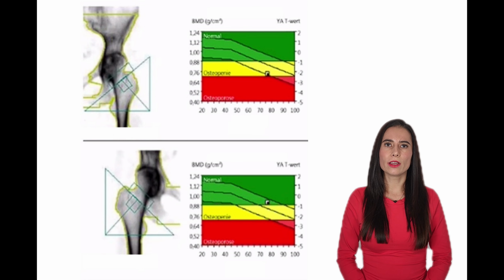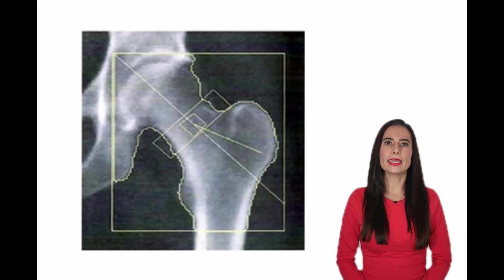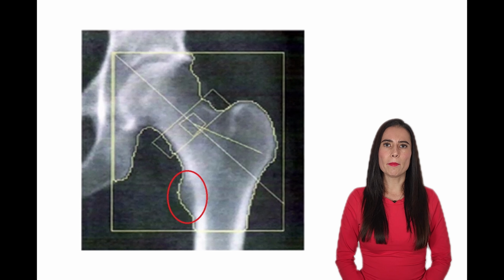In case of unilateral valgus deformity of the hip, it is recommended to measure the other side as well for better diagnostic information. On the other hand, arthrosis may limit the range of motion of joints, reducing the internal rotation of the hip, making it impossible to not include the lesser trochanter in the image. The straight positioning of the femur diaphysis may fail too.